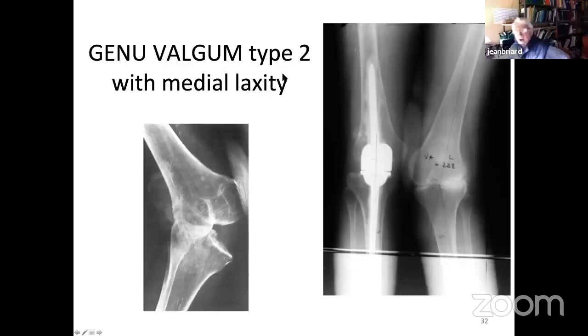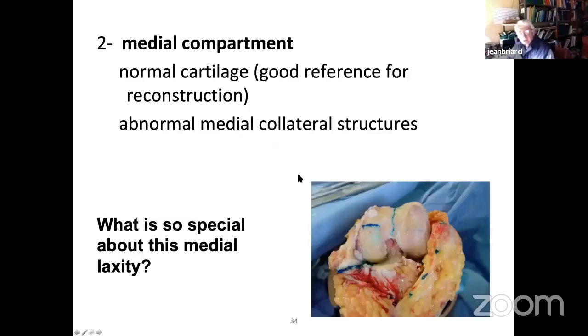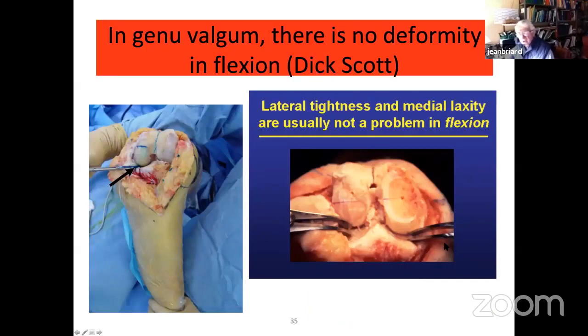Okay, now if you have medial laxity, that's very, very difficult. If you have this one, you have to use a hinge. And you have to decide if you want a fixed hinge or a rotating hinge, depending on the hip and the foot. So what's the pathology? On the lateral compartment, it's the same. But medially, you have normal cartilage. So what is so special about the medial structures? You remember the slide of Dick Scott saying that very often, no problem in flexion with the laxity.